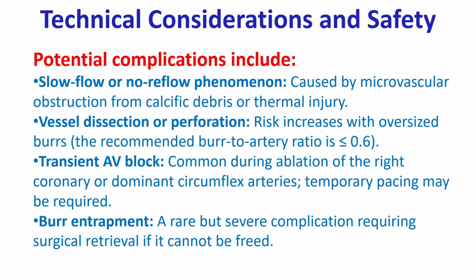Transient AV block is common during ablation of the right coronary or dominant circumflex arteries. Temporary pacing may be required. Burr entrapment is a rare but severe complication requiring surgical retrieval if it cannot be freed.